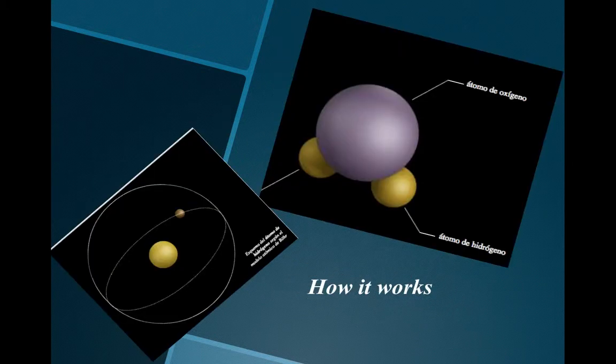How does this work? MRI uses hydrogen atoms because it is a very abundant element in the human body. Its nucleus has one proton, and this atomic nucleus has a magnetic moment, and the protons are in constant motion, rotation, and under magnetic fields, the precession is the magnetic moment.